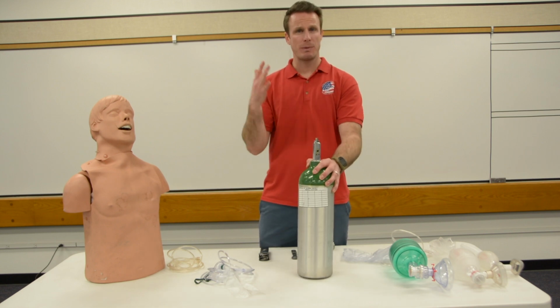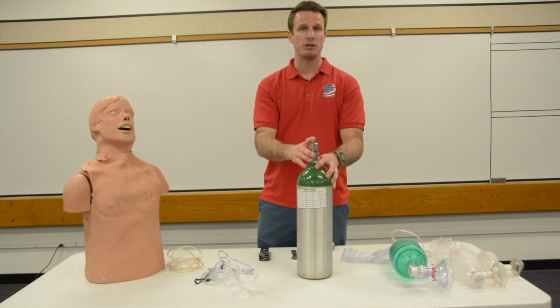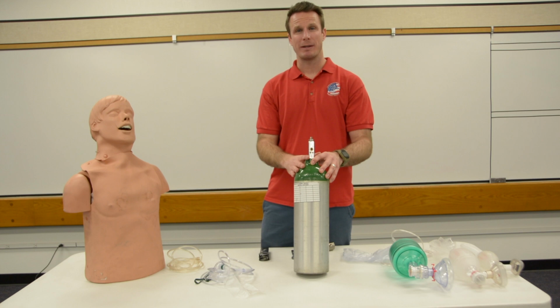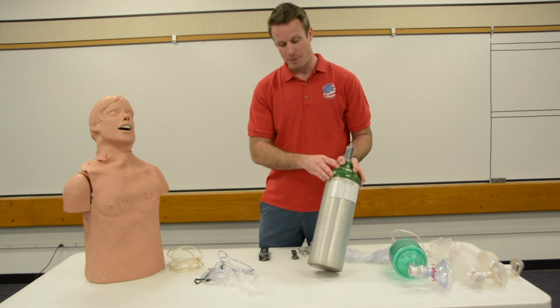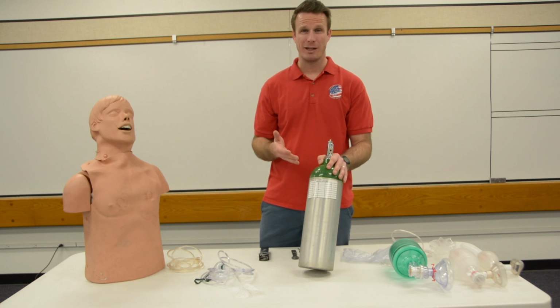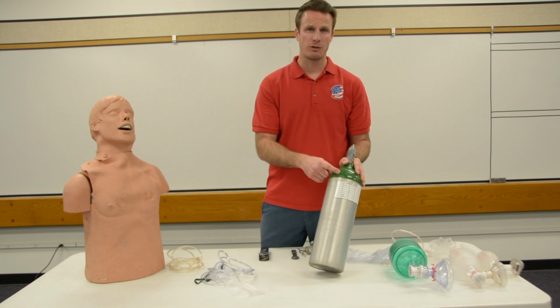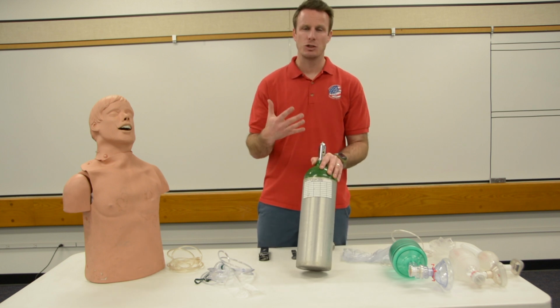First thing I want to do is make sure I have my PPE on, my personal protective equipment, before I start any of my skills. After that, I'm going to check my tank out, make sure there's no cracks or any damage to this tank, make sure that it's actually intact before I use it. Other thing we can notice about this tank is green is the color of oxygen, so whenever we see that we've got a green tank, we can know that oxygen is the gas that's going to be inside of this.